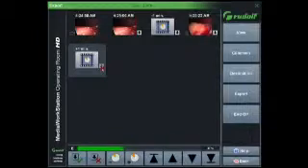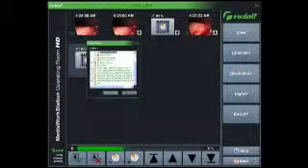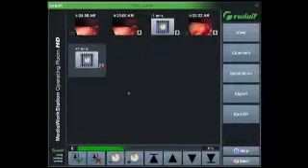As an alternative to the export to an external USB medium, which is a factory setting, it's possible to use other transportable media. For instance, a transportable hard disk or DVD burner, Blu-ray disc burner, or to implement the integration in an existing network. In this event, data are archived in a defined network target path, for example the PC of the surgeon, or on a central server in the hospital system. By confirming the export function, the data are automatically sent to the corresponding target medium.